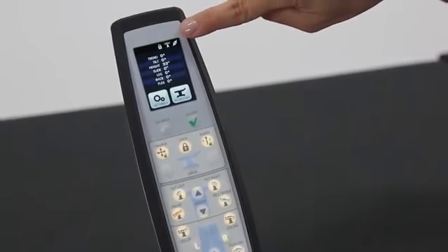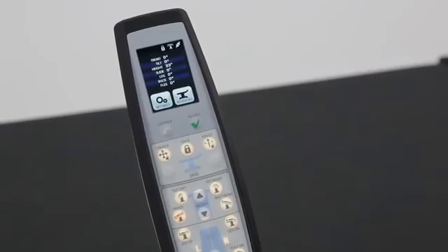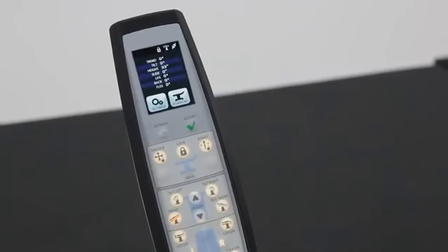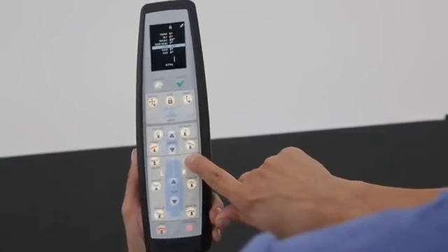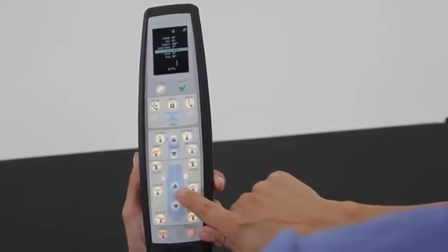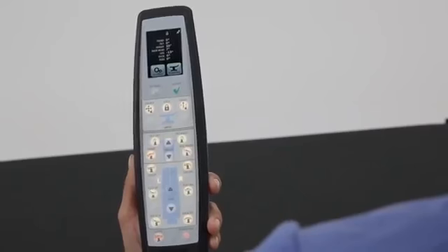At all times, the screen indicates locking status, fifth wheel activation and tables leveling state. Should you encounter an audible tone, which prevents a function, the remote will visually tell the user what to do by illuminating the button of the required action.